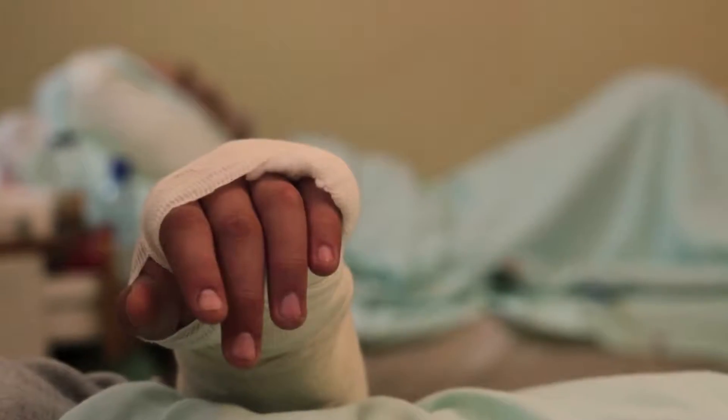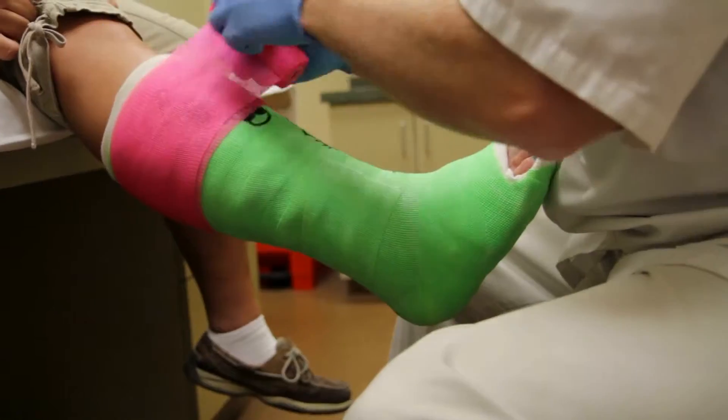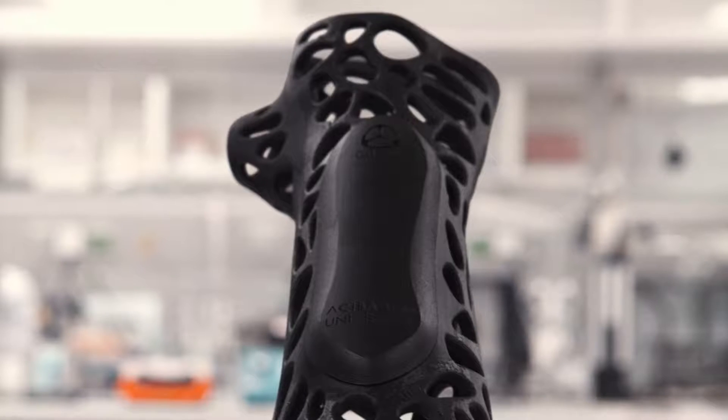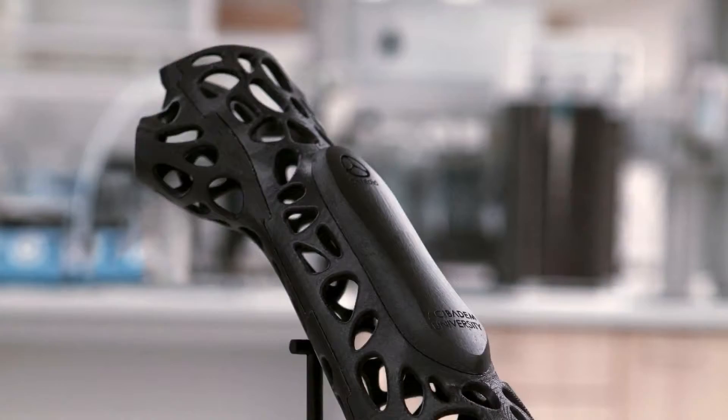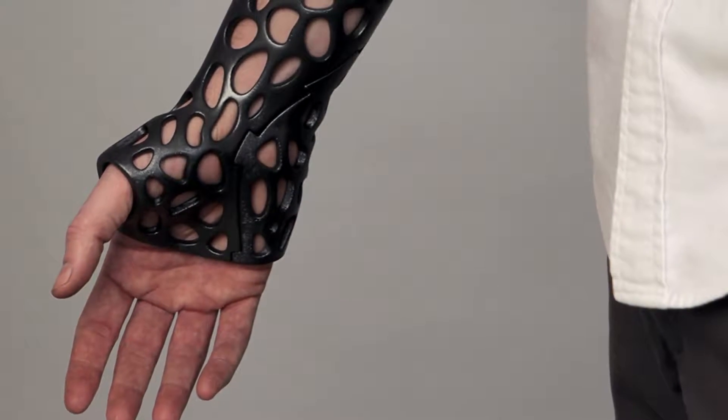Anyone who's suffered a broken bone knows the worst part isn't the pain, but what follows. Weeks of enduring that itchy, stinking, annoying cast. But this new plastic, spiderweb-like cast turns your broken limb into a fashion statement.